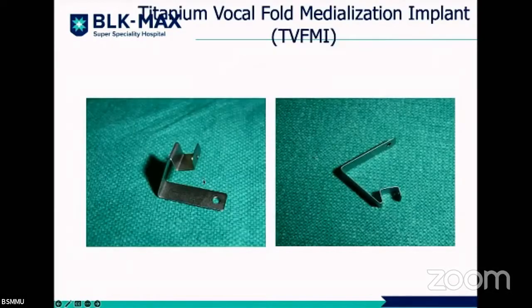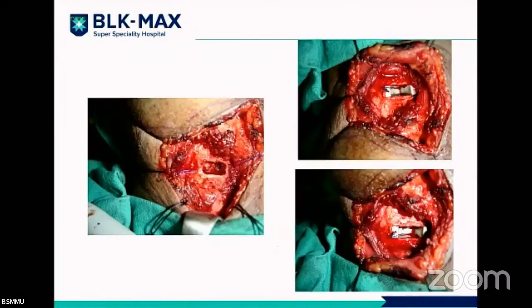TVFMI has been devised by Professor Gerald Friedrich of Austria, and we have used about 36 cases, and the advantage is very quick and very nice, secure, no extrusion. But the only disadvantage is the cost factor. It is about 20,000 in Indian rupees. I will also be showing you a video of how TVFMI is inserted.